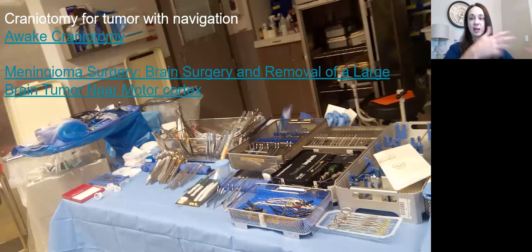So again, they're looking at a live image of their CT scan, usually not MRI, but there's options. The one I used was Medtronic. There's one called Brain Lab too. There's lots of different options, but the idea is they're looking at a live image so they could hold a probe up to that tumor and they can decide their trajectory. They need to know whether to approach it more laterally or more medially. They need to know the best way to get to that tumor without causing the least amount of damage. That's what navigation does. So a lot of craniotomies are done with navigation now.